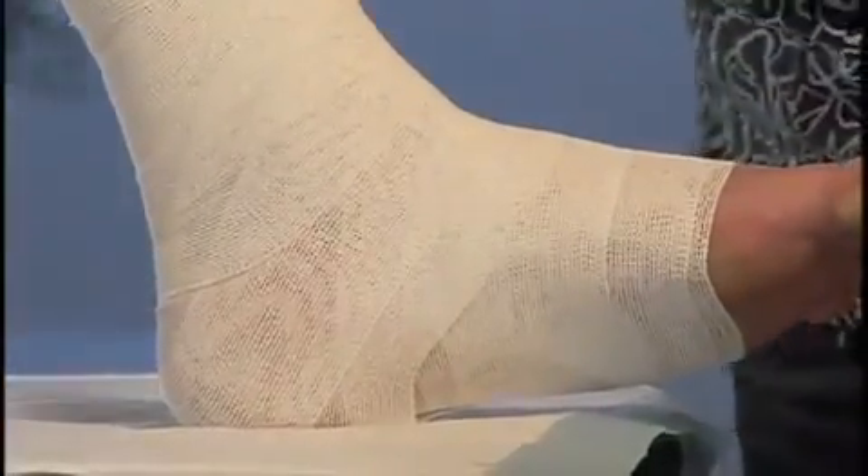As the bandage dries, it becomes rigid. Upon ambulation, the rigid bandage restricts outward movement of the calf muscle, therefore directing the contraction force inward and improving the calf muscle pump and venous flow.